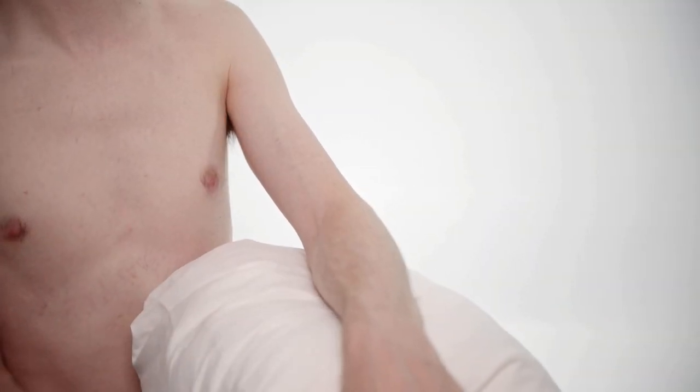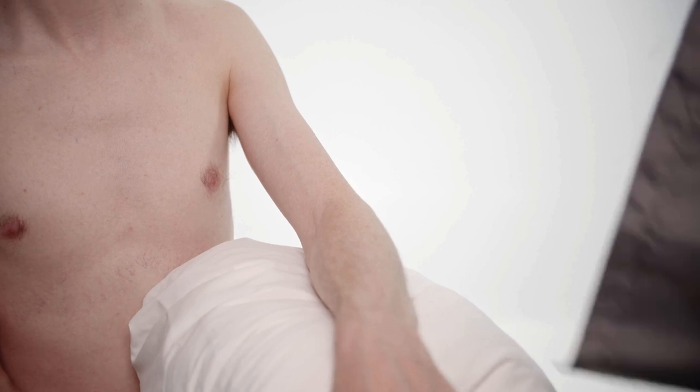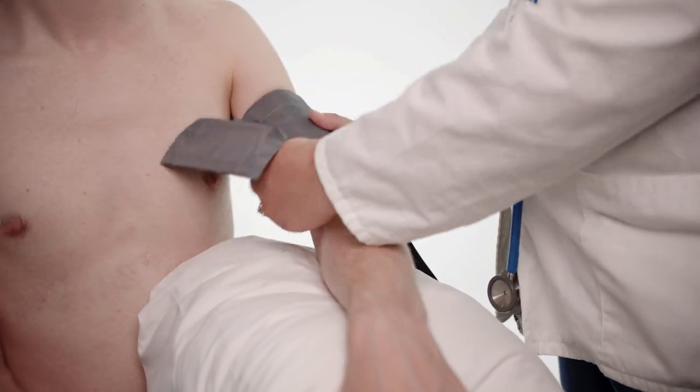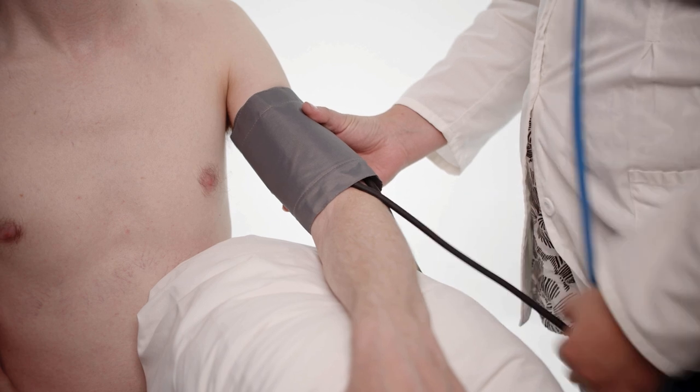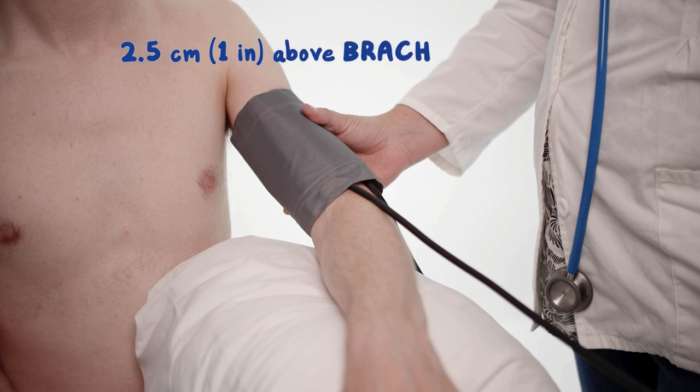Support the arm at heart level — it needs to be at heart level or the measurement might not come out right. Identify the brachial artery above the antecubital fossa and wrap the deflated cuff around the arm. The bladder of the cuff should be centered 2.5 cm or 1 inch above the brachial artery.